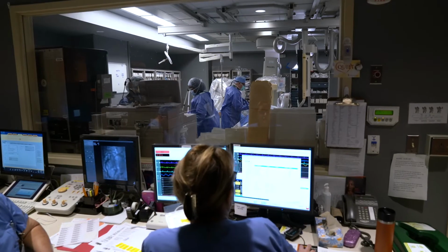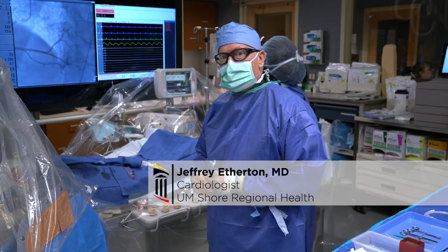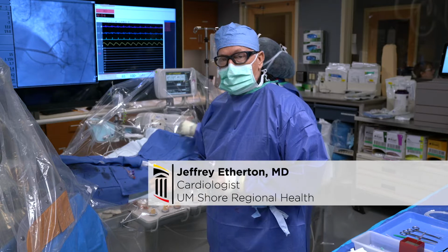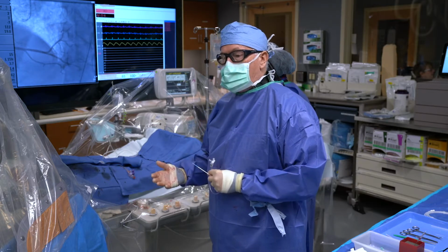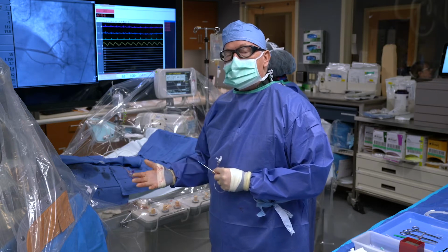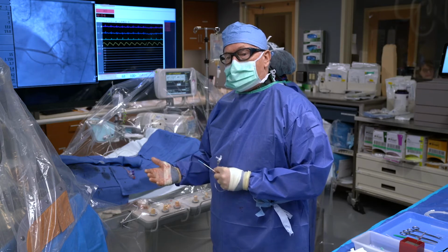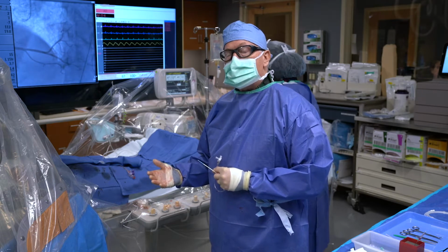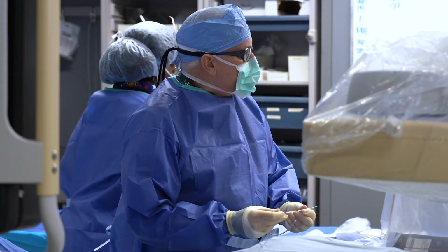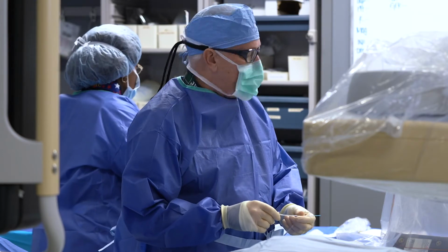The purpose of this laboratory is to invasively evaluate patients who have risk factors for coronary disease, symptoms of coronary disease and angina pectoris, which is a symptom of reduced blood flow to the heart, and then they've had non-invasive studies done as an outpatient that are suggesting that the patient may have significant coronary disease that's contributing to his symptoms. To perform the procedure, we will need to access the patient's central arterial system through the aorta.